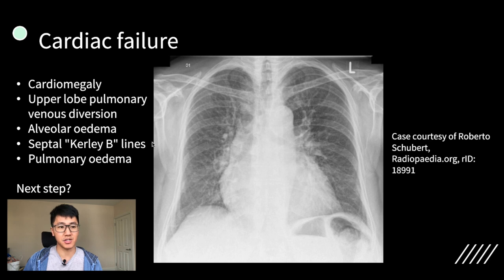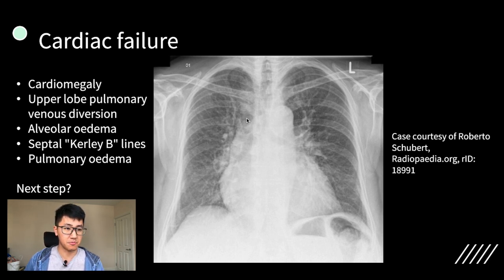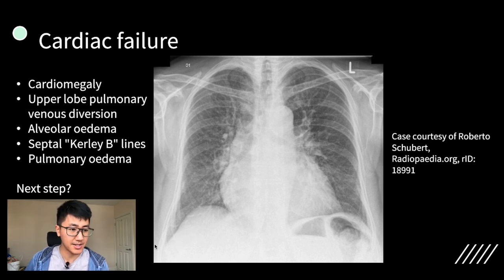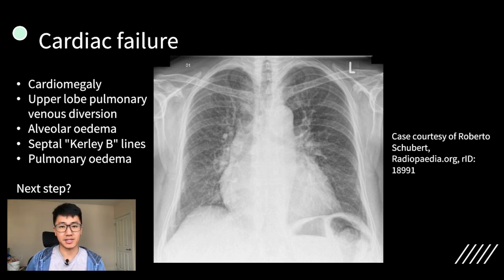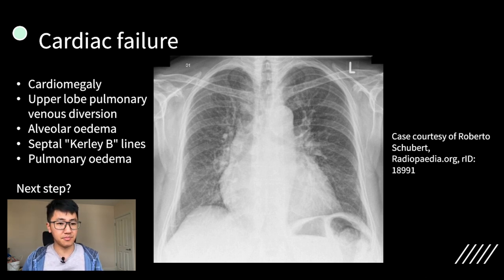Other features of cardiac failure include alveolar edema, which is a fluffy kind of perihilar edema. You can also look for septal Kerley B lines — I think there is one here in the right costophrenic angle. This essentially is interstitial edema. And again, you think about the next steps, so things like diuretics or doing other tests like BNP.